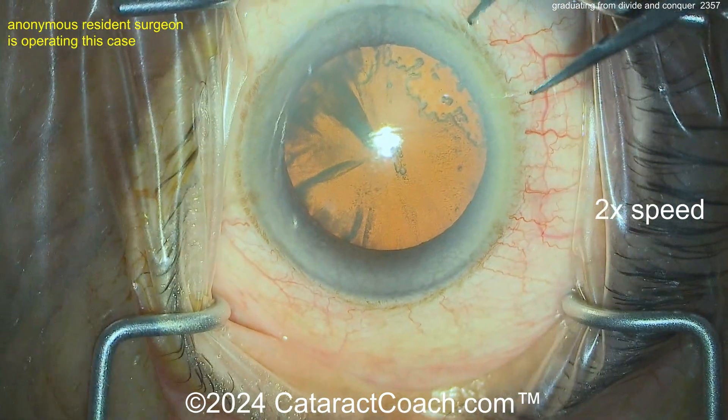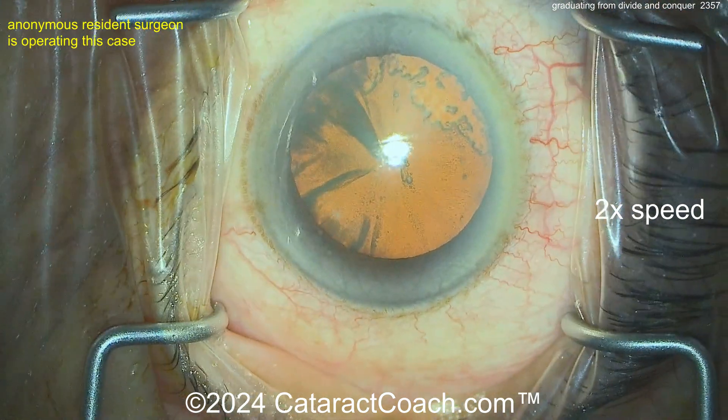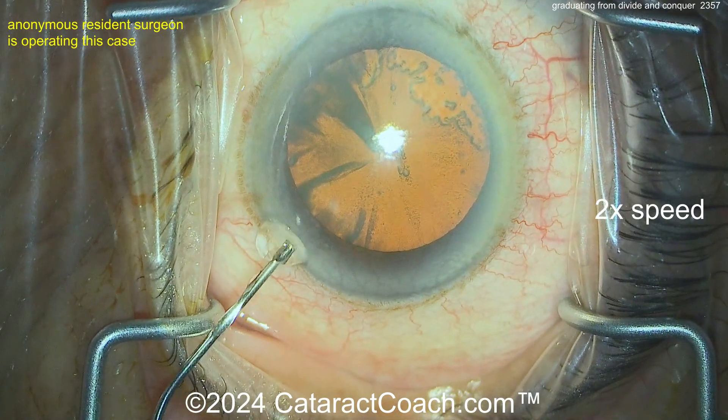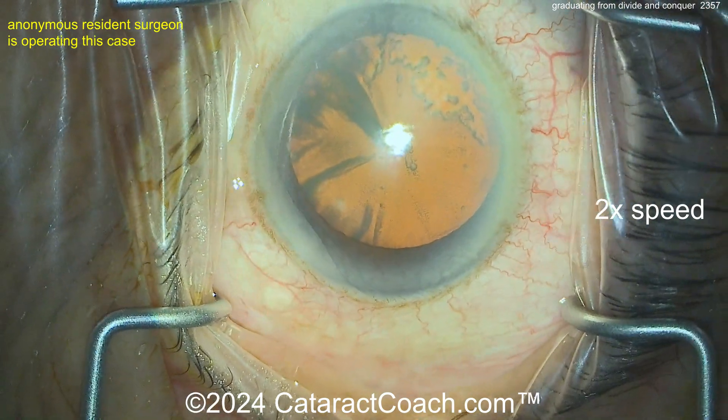There's one paracentesis — a little avascular for my tastes. Let's see the other paracentesis again — a little avascular for my tastes. I like to barely hit those limbal vessels. Now putting in some viscoelastic — that looks pretty reasonable.